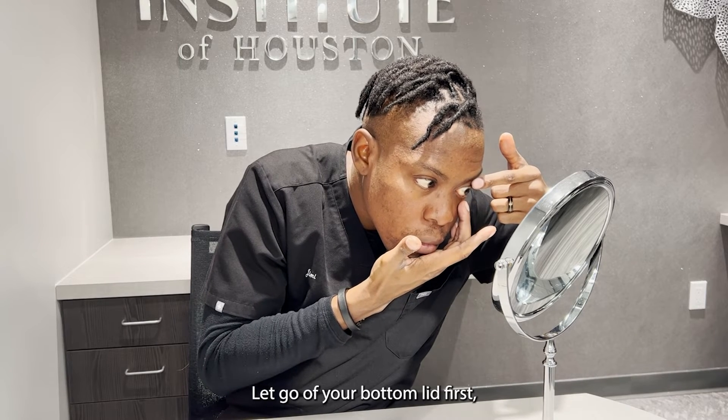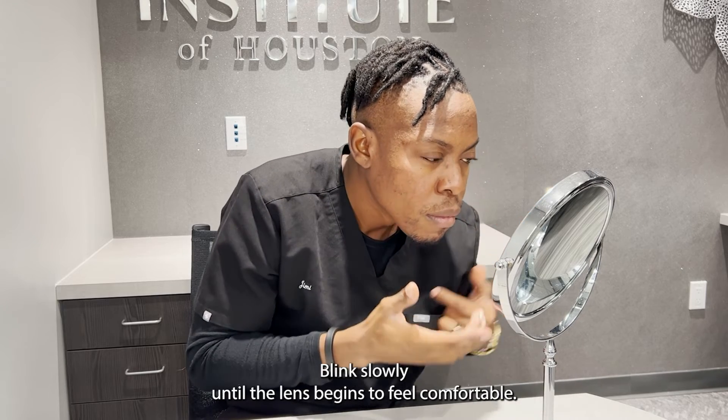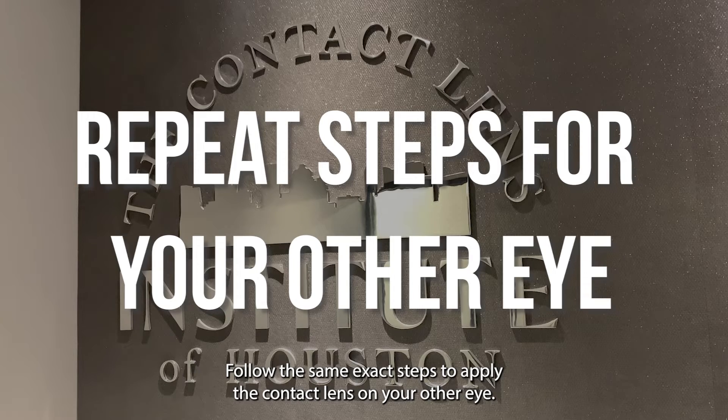Let go of your bottom lid first and then gently close your top eyelid. Blink slowly until the lens begins to feel comfortable. Follow the same exact steps to apply the contact lens on your other eye.